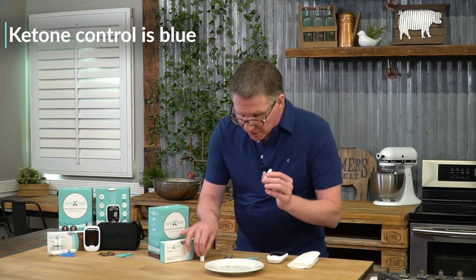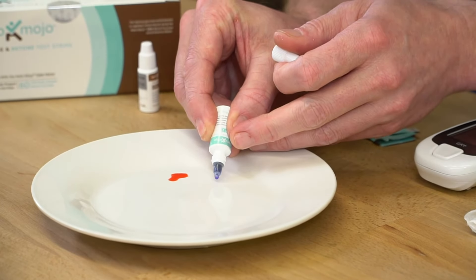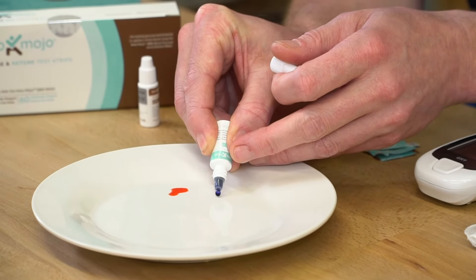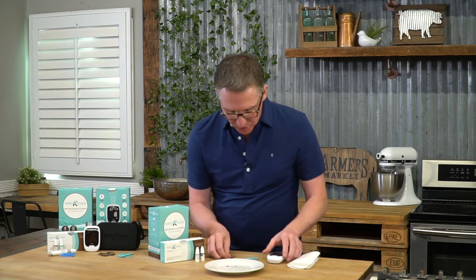I'm going to take a second one, which is going to be my ketone, so I can do them back to back. I'm going to put that one in there — little bead. Easy enough. Put that back. So first, glucose.